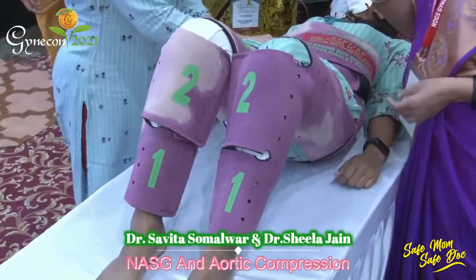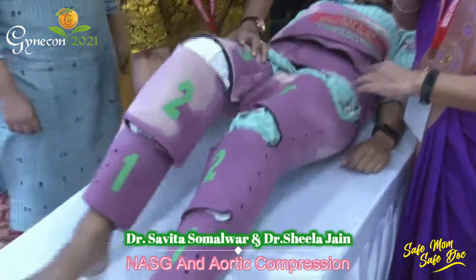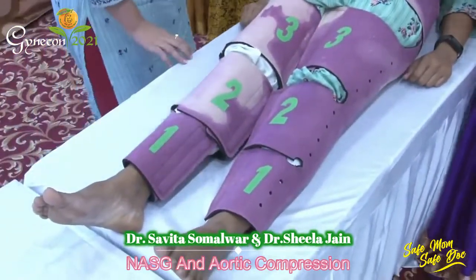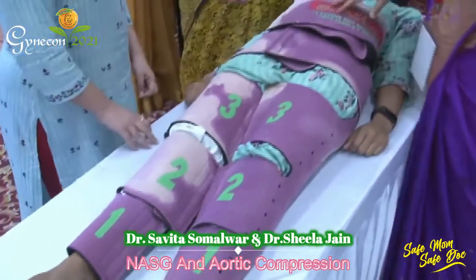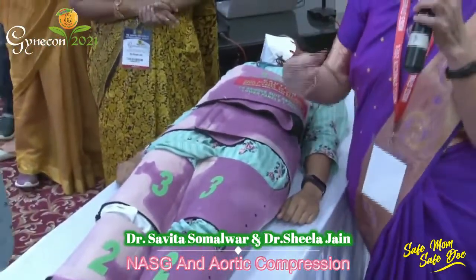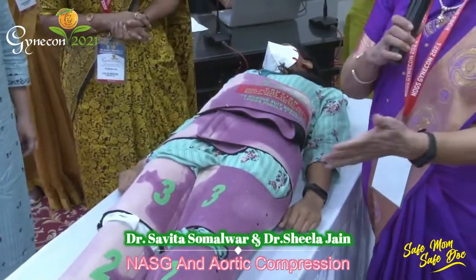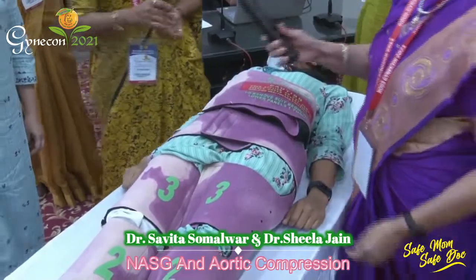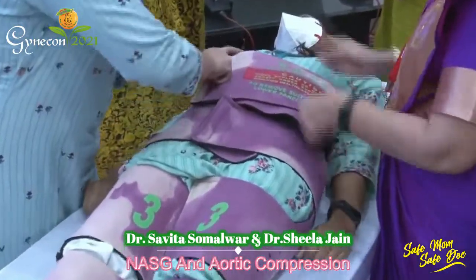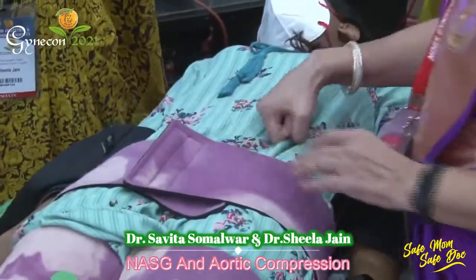You will have to remove one segment at a time, observing the vital signs for 15 minutes between each. It takes around 60 minutes to remove all segments. If there is a fall in BP or tachycardia, you may have to reapply the segment. You start removing from segment 1 up to segment 6.